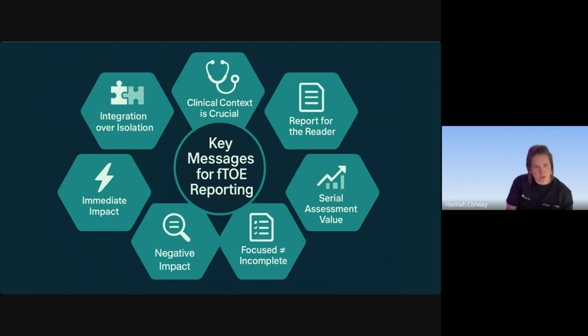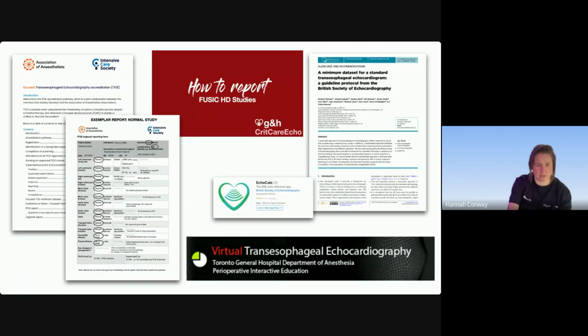And that's, for me, the summary of what I'd want you to take away from today in terms of reporting. In addition to that, I've left some little resources here for you. Obviously, one of them is the actual training pack, which you should refer back to. It's been updated. There's an exemplar report in there now, hopefully.